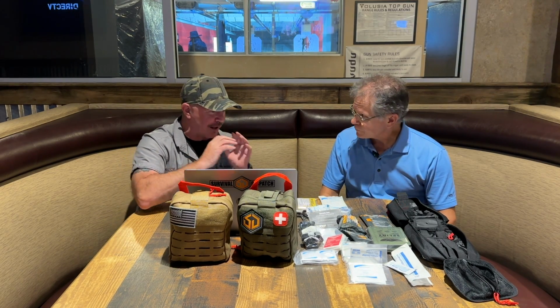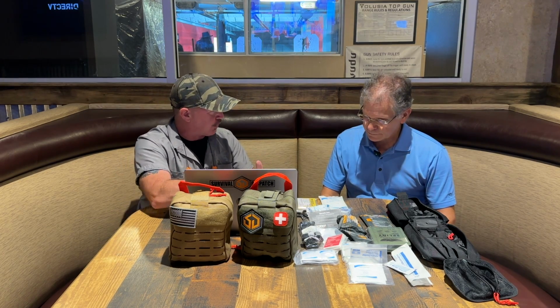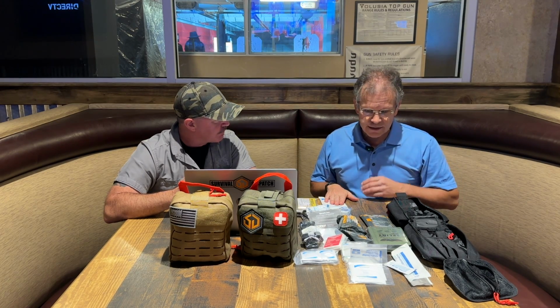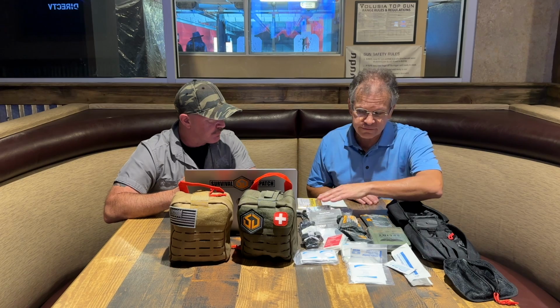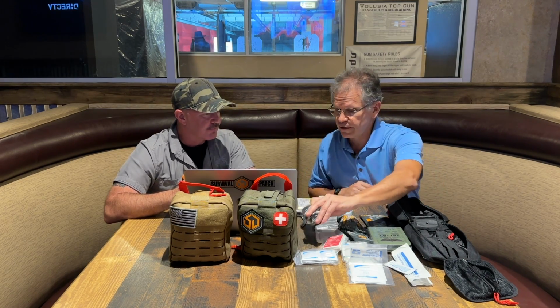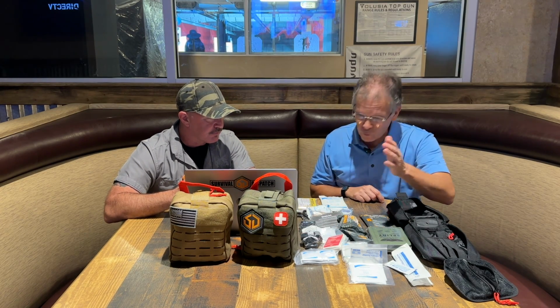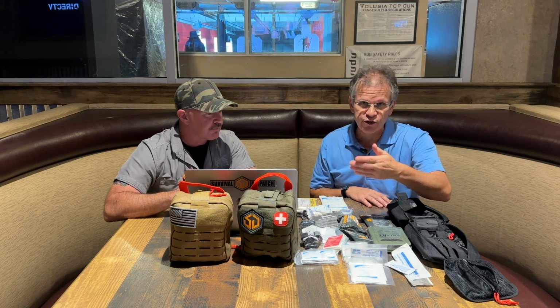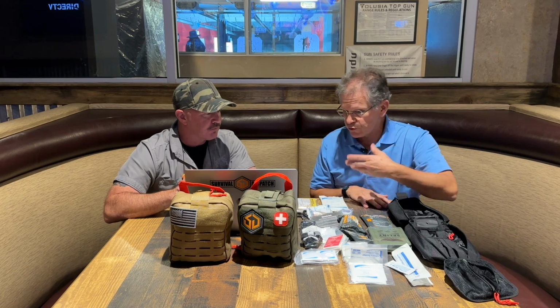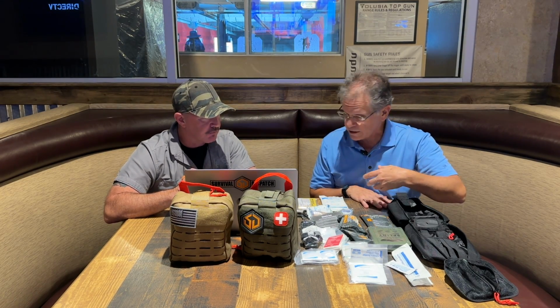So first off, what are the basic items that every individual first aid kit should have, and are they here? What's important in here is there's some gauze, big gauze, there's tape, gloves, ACE wrap, and the CAT tourniquet, which is the tourniquet for extremity injuries, especially if you've got bleeding from whatever injury that you have. If you're hiking and you fall and you have a huge cut and you're having blood vessel bleeding, it's critical to save your life to be able to get out of there in time without significant blood loss.